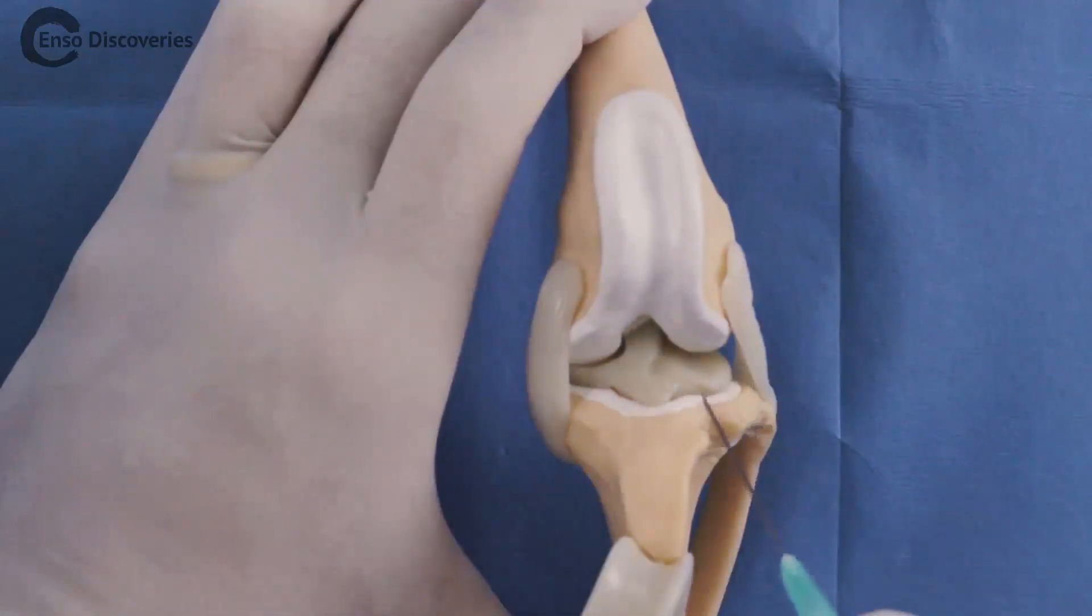Take care, especially with small animals, to avoid injecting through the back of the joint. Aiming proximally should avoid this.